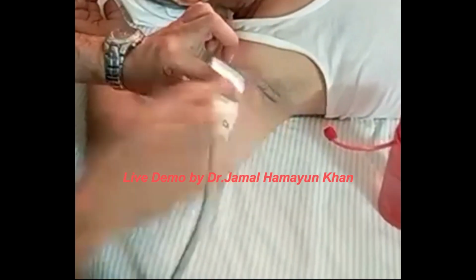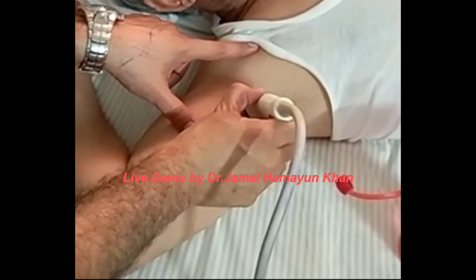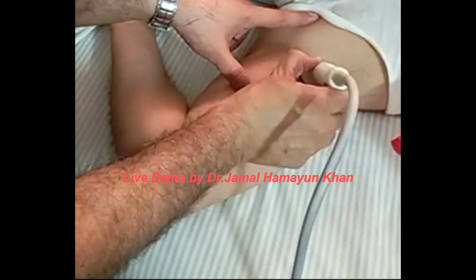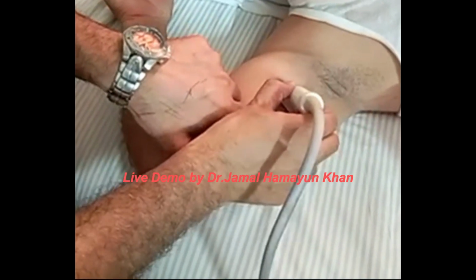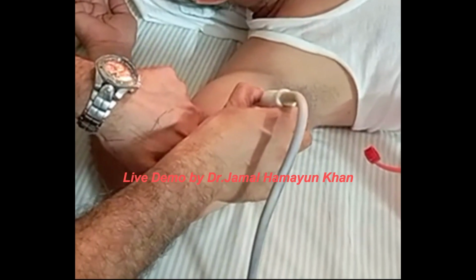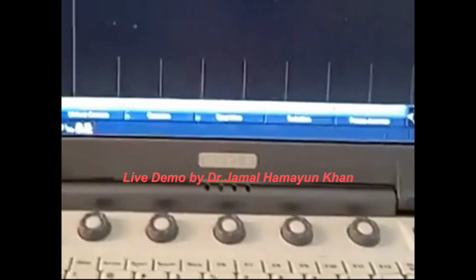So this is the axillary crease, and we are going to keep the probe onto the axillary crease to identify the axillary artery. That is the point from which we are going to identify all the structures around the artery. And then we are going to move laterally to find the musculocutaneous nerve. The musculocutaneous nerve will be found between the coracobrachialis and biceps brachii muscle. So first of all, we are going to keep it here.